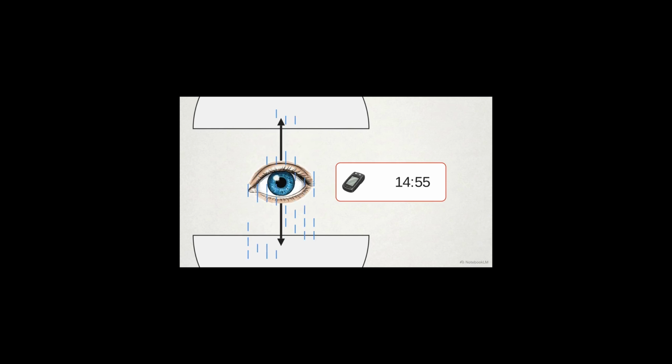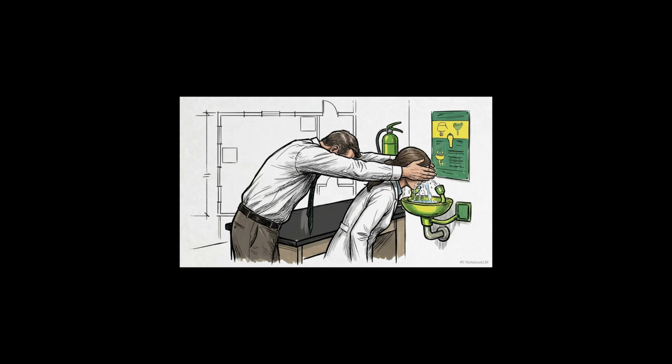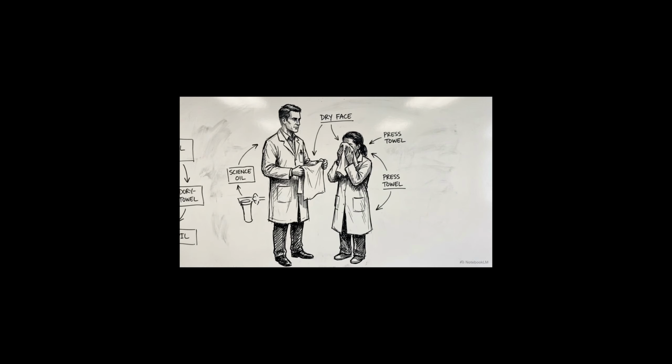This timer illustrates the safety standard's strict, non-negotiable time requirement. You must keep the eyes flushed in that water stream for 15 full minutes. Executing this 15-minute hold is physically uncomfortable for both of you, but completing it clears the chemical and specifically shields you, the instructor, from nonfeasance liability.